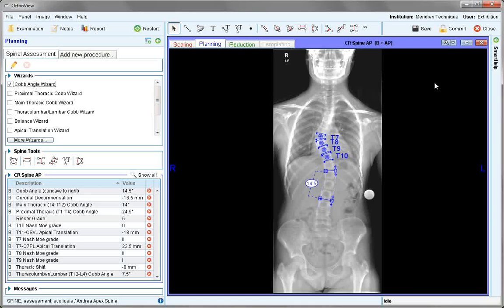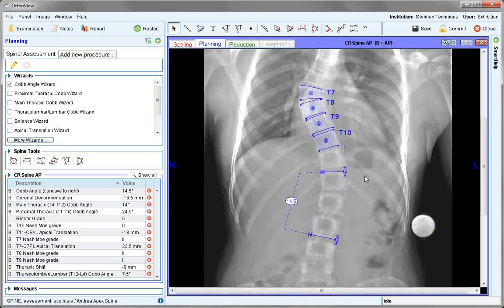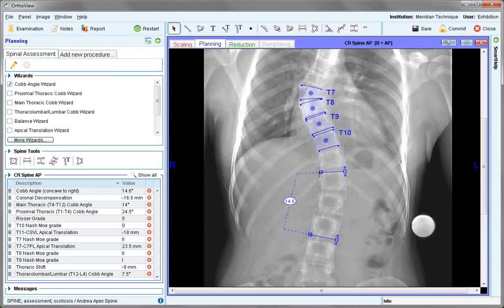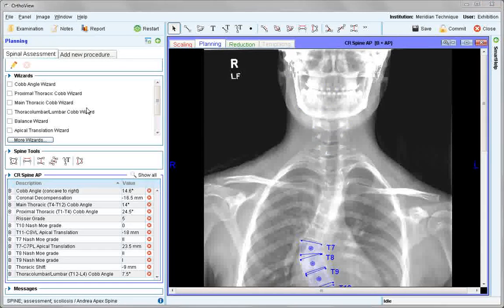It's possible to zoom in for placement and adjust the handles for the curvature of interest. The value will change and be recorded in the planning results panel. Removing the Cobb angle wizard, we now look at the proximal thoracic Cobb — it's one of a set of three.